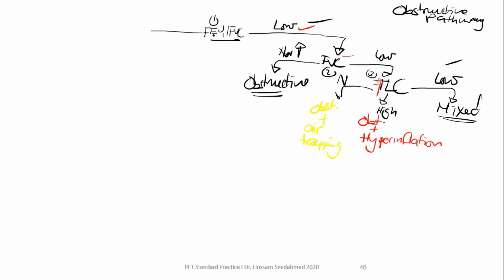So now اللي نحن الآن ماشيين بالخطوات. Step 1 look at the ratio. If it is low معناتها أنا حنتقل إلى the obstructive pathway. طيب الخطوة اللي بعديها بعين ال FVC. إذا لقيت ال FVC low دي معناتها ماشي لي كده في اتجاه ال restrictive. فقوم الخطوة اللي بعديها 3 determine the restriction بالTLC. If the total lung capacity is low دي بتبقى mixed both obstructive and restrictive. ليه؟ لأنها restrictive ماخذ اللو TLC obstructive لأنها ماخذ اللو ratio.